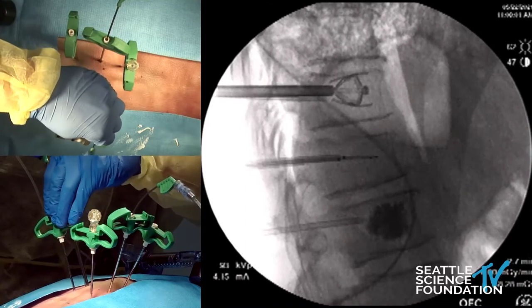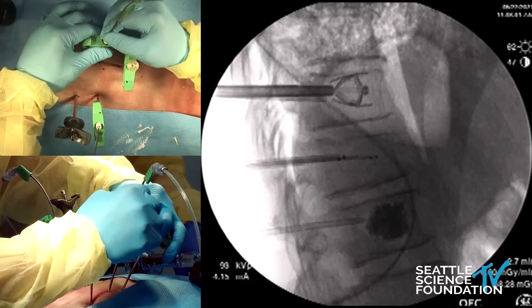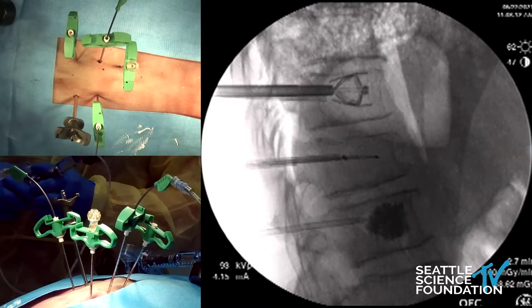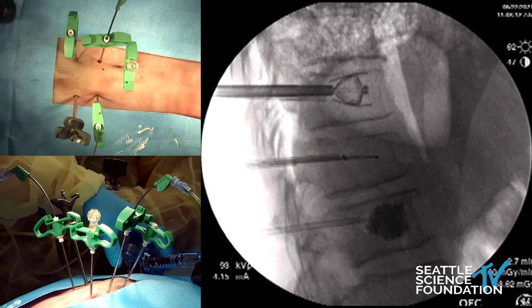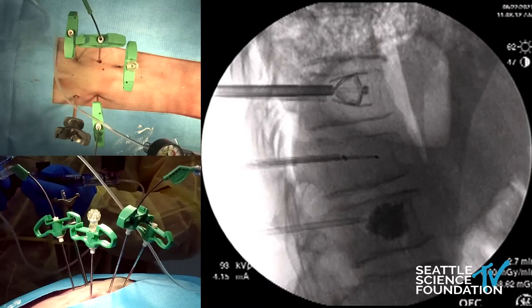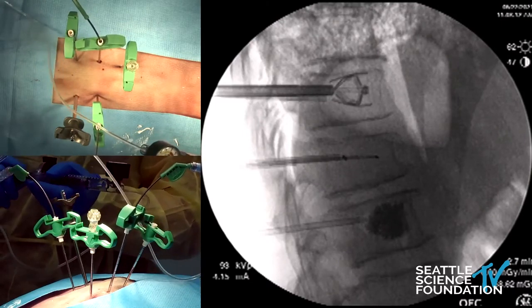Push yours just a touch forward because you're kind of close to the cannula, or you can back the cannula up. We're clear there — we've got a nice spot. What we're going to do is gently go up on the pressure here. You can actually feel a tactile feedback of when you're starting to get some pressure against the moving bone.